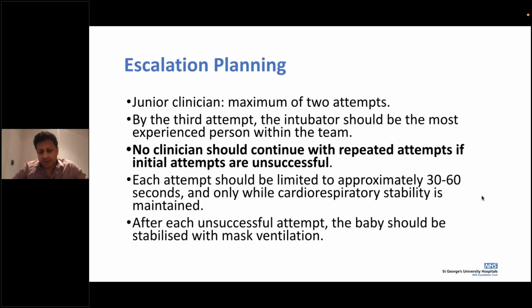Now, a word around this. There are times when you're intubating and you might find there are far too many people. There are nurses, there is a middle grade, there may be a consultant, and there are at least a couple of other nurses who are drawing up medication.